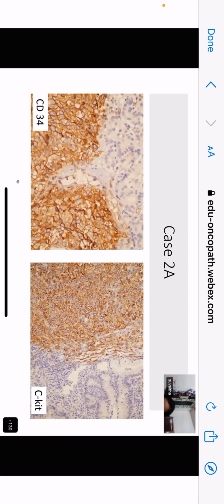What is that? What is CKIT? It's called CKIT. It is also known as CD117. What is that? No, ma'am. You don't know, Suvaita. Will somebody like to tell her? Limpy, what is CKIT? CD117? Marker for GIST. It's a marker for gastrointestinal stromal tumor.